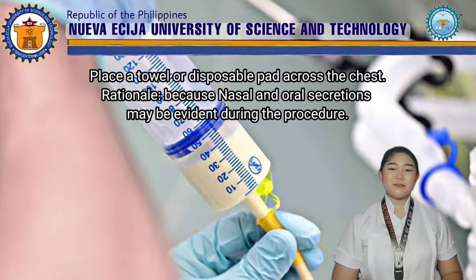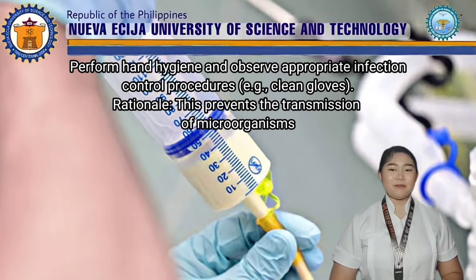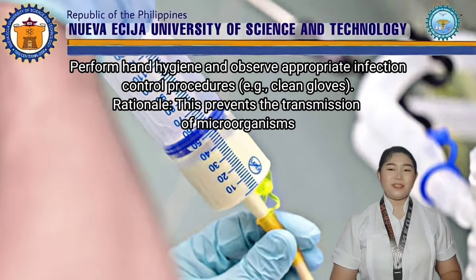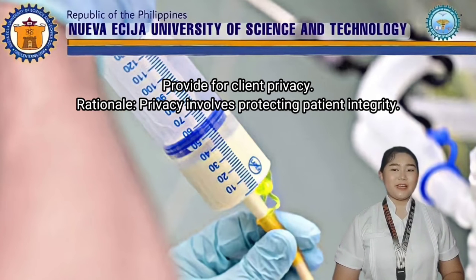Place a towel or disposable pad across the chest. Rationale: because nasal and oral secretions may be evident during the procedure. Perform hand hygiene and observe appropriate infection control procedure. Rationale: this prevents the transmission of microorganisms. Provide for client privacy. Rationale: privacy involves protecting patient integrity.